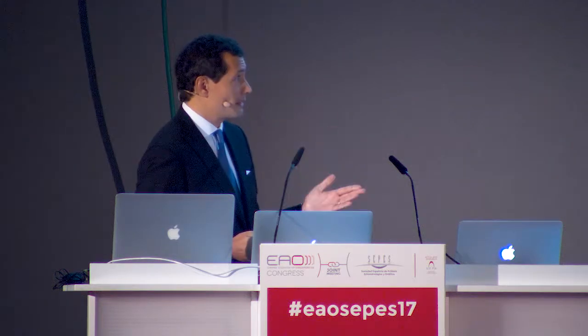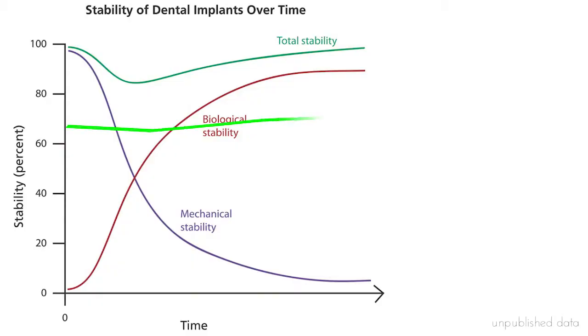So if I go back to this graph that was explained in great detail by Dr. Eckert, that's the trend that I see with native bone, and this is the trend that I see in grafted sites. So what does it mean? That generally speaking, what I find after our technique for guided bone regeneration, the augmented bone has a higher bone density compared to the native bone.